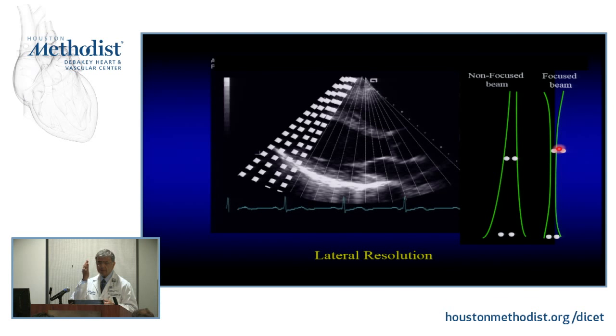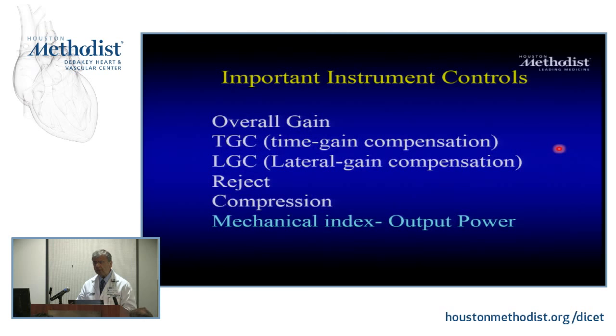You have the best reflection of ultrasound in addition to your best resolution of it. Okay? So now we send these bursts, they come back, we analyze them for speed, and that's how your scale is. Your scale is because of what the speed of ultrasound is in the body, and how long it took for that little burst to come back and reflect on the screen. So I know I can have a depth scale, although it is not a true depth scale, right? Solving the equation, and the equation is fine throughout.